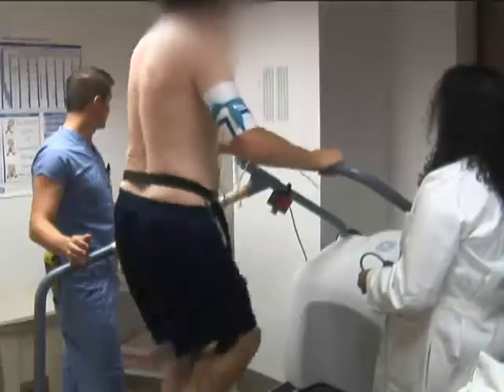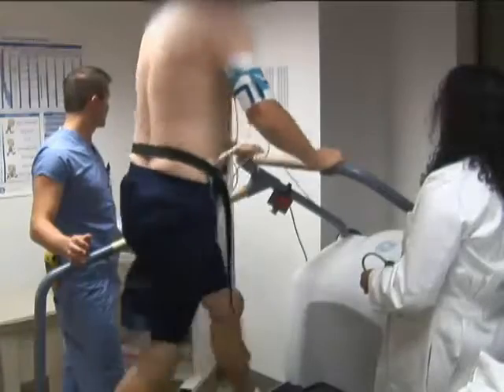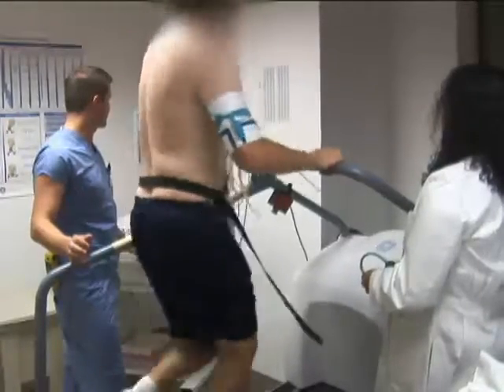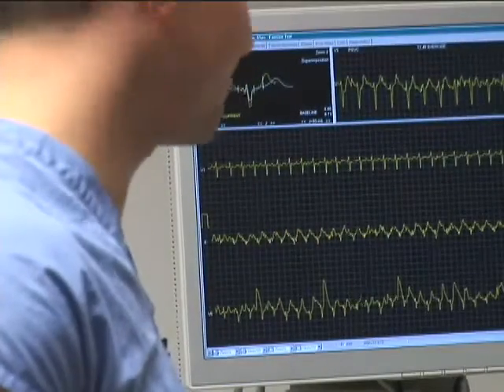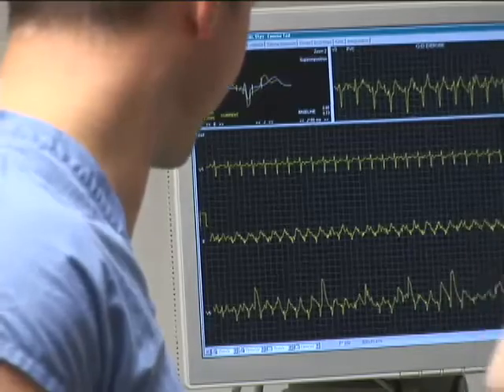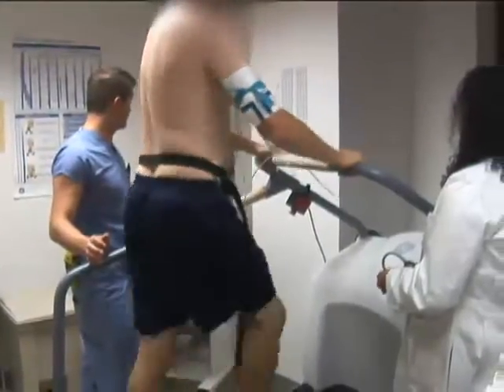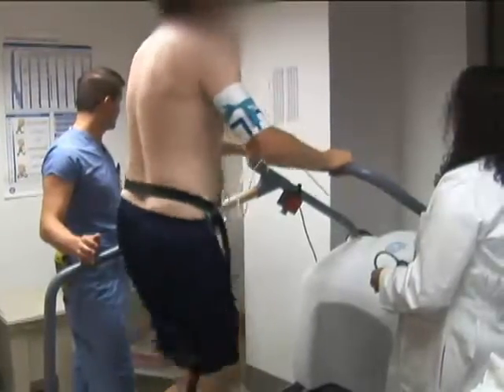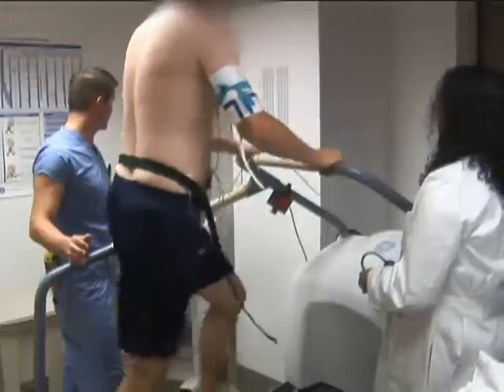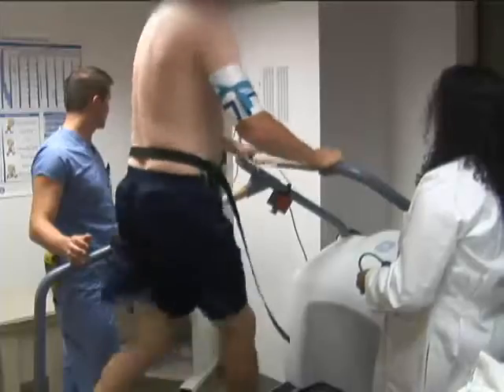If the patient does not achieve target heart rate, negative test results should be recorded as a non-diagnostic study in the context of the workload achieved. Treadmill exercise should be halted by the supervising provider with any development of severe angina, ataxia, dizziness, systolic blood pressures over 220 millimeters mercury, a hypotensive response or decrease in systolic blood pressure, concerning ECG changes, or significant arrhythmias.